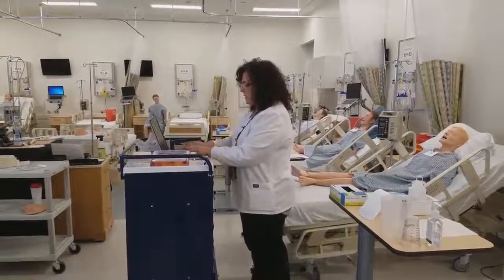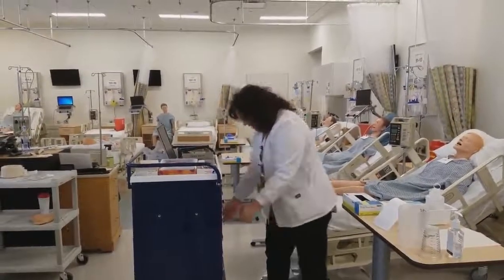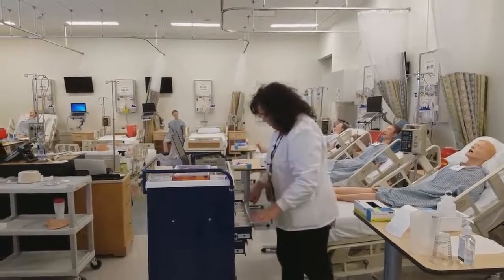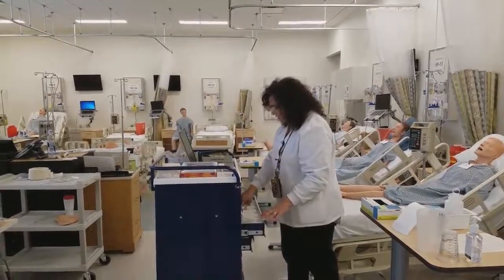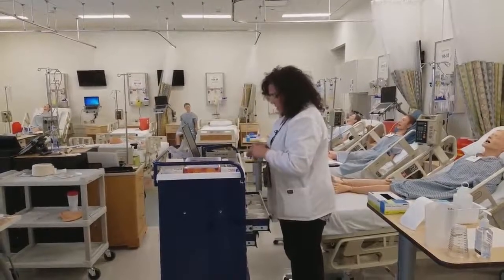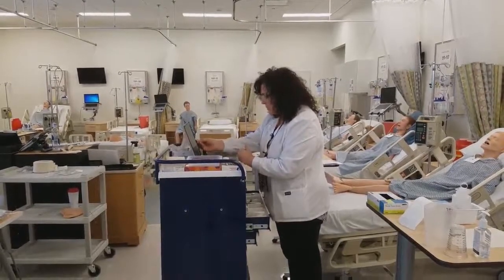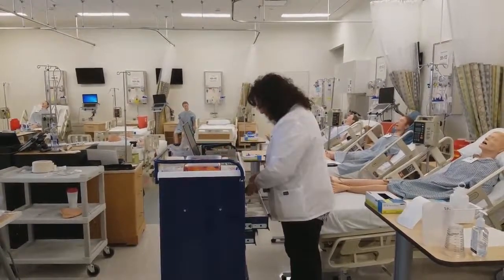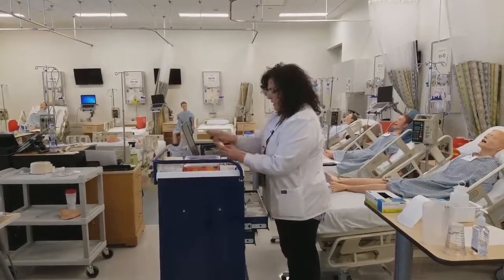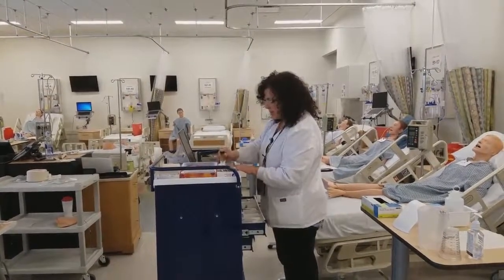Okay, so now in the med room, I'm going to pull up Duke Blue Devil's EMAR. And I'm going to pull out his meds, and based on my review of the chart before or at the beginning of my shift, I know that I have 2 medicines to give him at this hour. One is a multivitamin, so I will go ahead and perform check 1. And the next one is a liquid. This is lactulose, and again, I'm going to check it up against the EMAR, and that satisfies check 1.